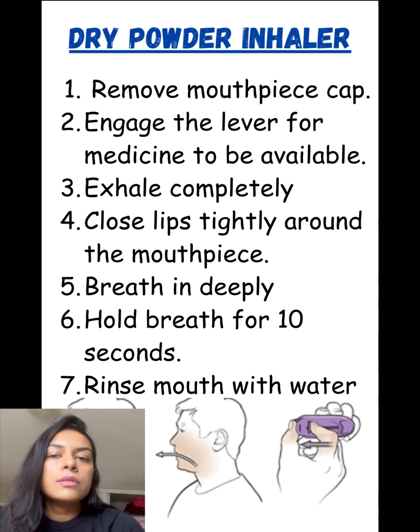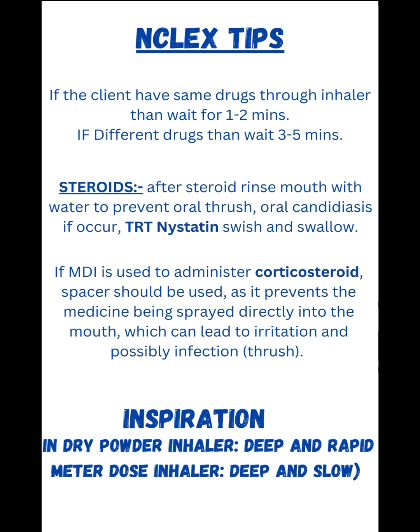And that's it for the steps. If the client is using the same drug's inhaler, we need to wait around 1 to 2 minutes between inhaler uses. And if the client is using a different drug's inhaler, then we need to wait around 3 to 5 minutes between inhaler uses.